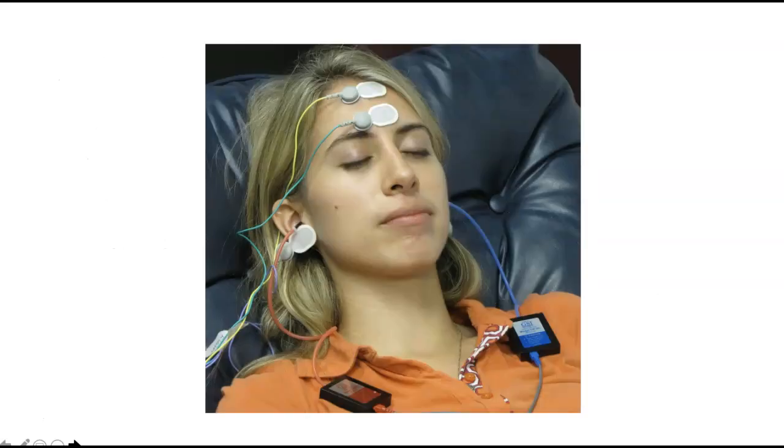So here you have a young lady who's being tested. Here you have the insert here and here for the right and then the left ear. You have a green electrode, which is your ground electrode, so there's no shock. Now remember, these are recording electrodes, they're not stimulating electrodes. So there's nothing going outward from the electrodes, they're only recording electrodes. Here you have an electrode on the forehead, and then you have an electrode here and an electrode on the other side. And this is from where the response is recorded, thus a far field response, because we're talking about a response from the brainstem, which is down here behind the person, obviously, and on the back.